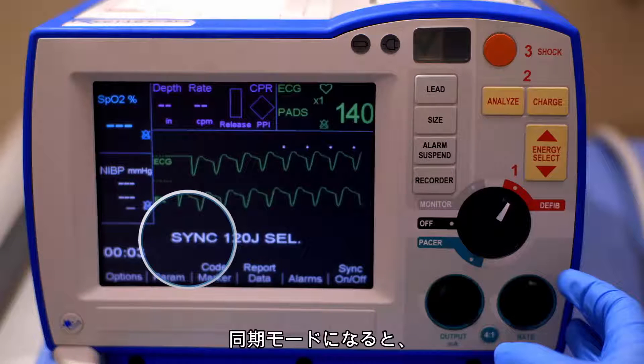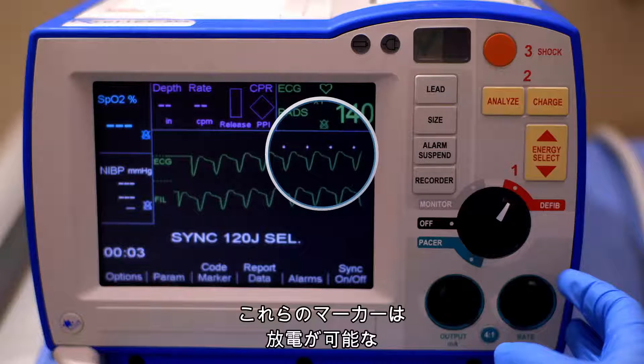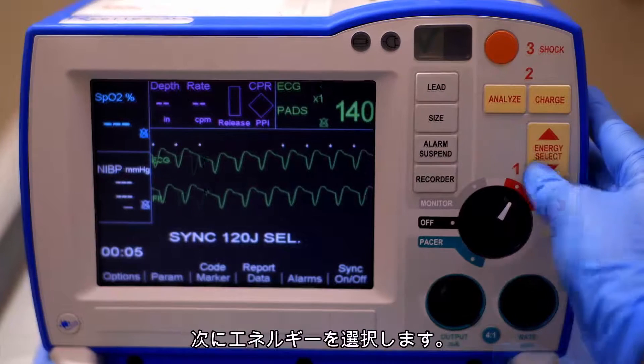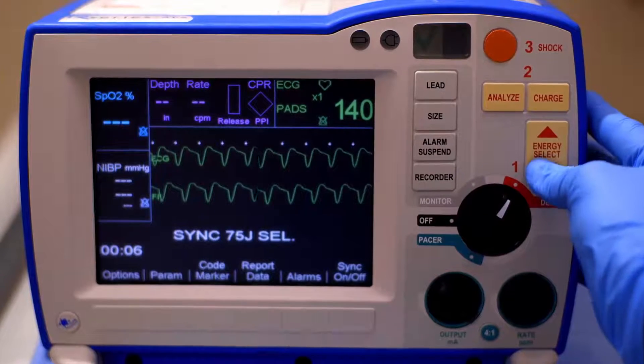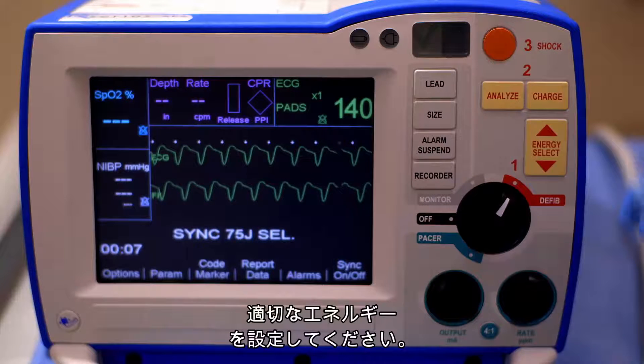Once in SYNC mode, the device displays down arrow markers above the R-Wave. These markers indicate points in the cardiac cycle where discharge can occur. Next, select your energy. Always follow your institution protocol to determine appropriate energy settings.